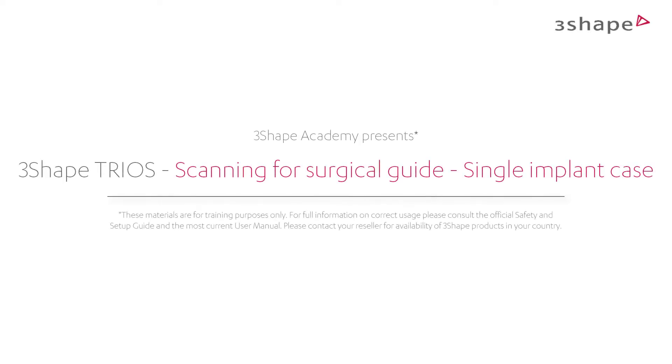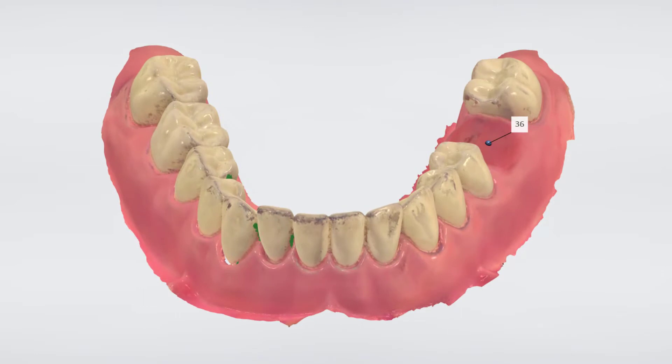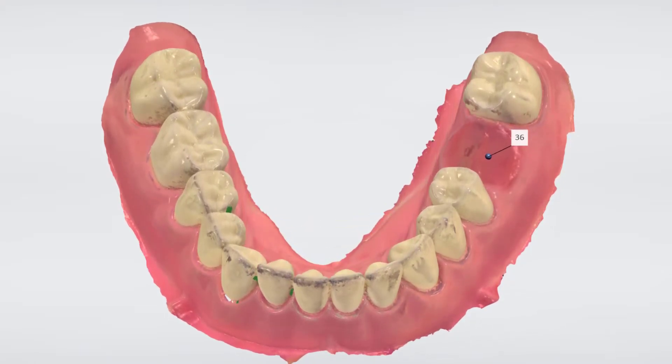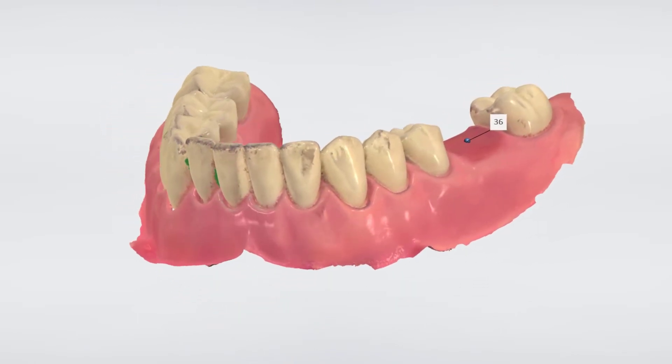Welcome to this how-to scan for surgical guide series, where we will explain how to scan for a particular case. In this video we will show you how to scan a patient with a single implant. Here we have a missing first molar. The region has several anatomical structures that have to be taken into consideration. We're going to use the Trios to scan the quadrant to facilitate implant planning and the design of a tooth-supported surgical guide.